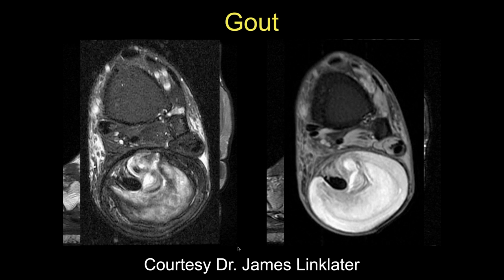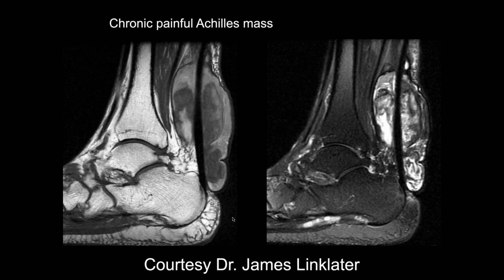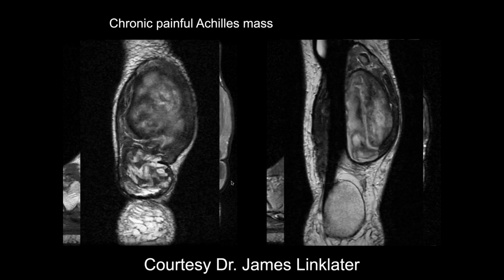Doesn't that involve the skin there, John? Involve the skin? I think the skin is being displaced here, I believe. Yeah, it certainly goes up to the skin. But here's the deep fascia right here. So it's really pushing out the deep fascia of the skin.